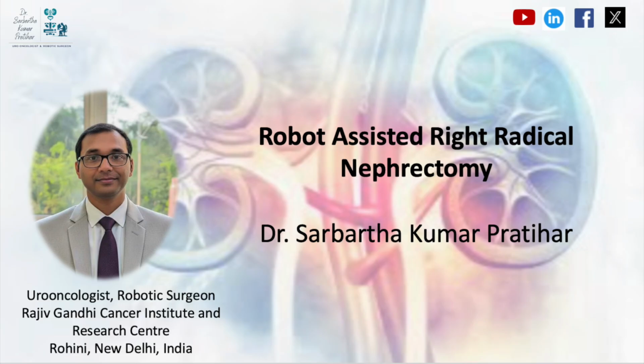The key challenge in this case was a large renal mass which was falling medially so that it was difficult for retraction, and multiple renal arteries at the renal hilum.